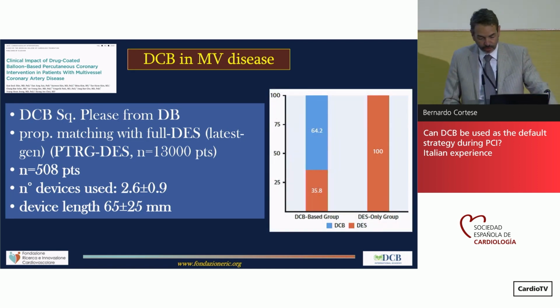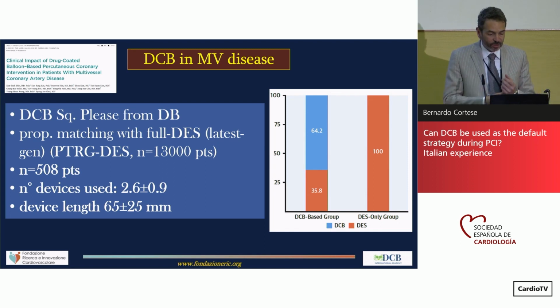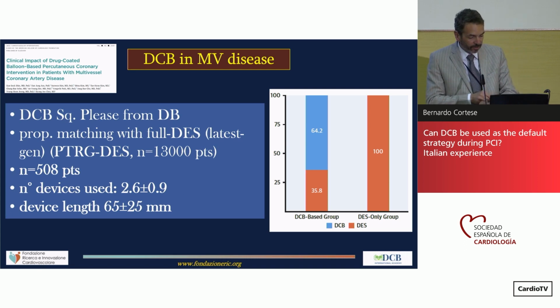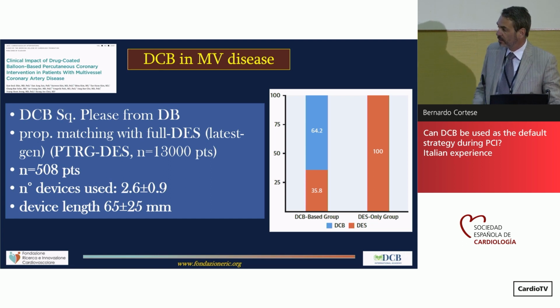We have seen this study, so I will go fast. Obviously, in these meetings, some slides are repeated, but I think it is important to convey an important message. One is that if we have multivessel disease, we don't have to think only of paving the coronary arteries of our patients, because we may use a blended therapy. This name I took from Patrick. I like it more than hybrid as well. And this study is very easy in how it was done. It's a retrospective analysis of 2 prospective studies, propensity matching, blended therapy versus full DES. In the blended therapy, in 2/3 of the length of the lesions, a DCB was used.